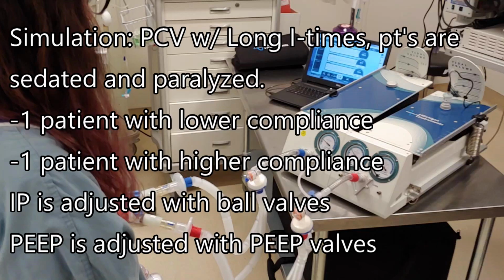Our simulation uses pressure-controlled ventilation with long inspiratory times. Patients would be paralyzed and sedated. The long inspiratory times and preferably inverse I:E ratios, 1.5 to 1, 2 to 1, somewhere around there, would be preferable for our patients with stiff lungs anyway and allow the vent to evenly distribute gas to each patient.